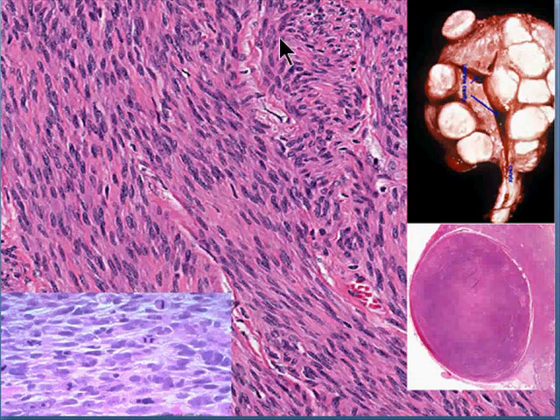If they looked exactly like normal smooth muscle histologically, you could probably classify it as a benign leiomyoma. If, on the other hand, the cells microscopically looked like this, with a lot of mitotic figures as well as other features we'll talk about, you might call it a leiomyosarcoma. And that is indeed the case.